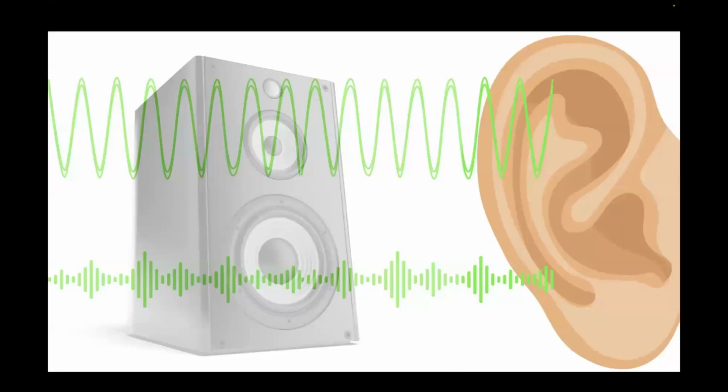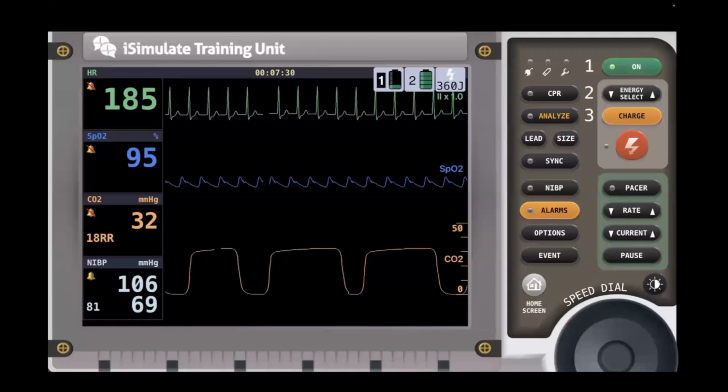You can hear rhythmicity better than you can see it. So close your eyes. I'm going to play a couple rhythms for you. Tell me which one's regular and which one's irregular.